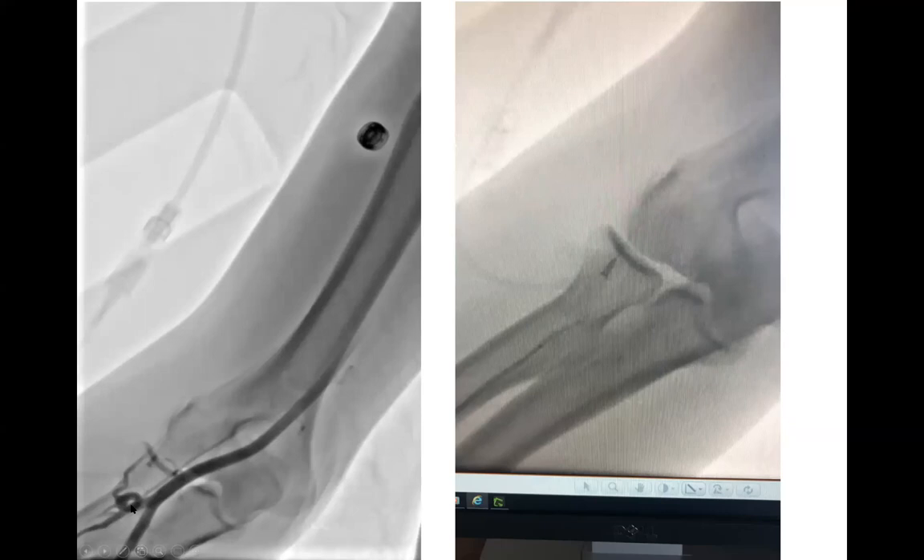We took an image instead. The patient was in his 50s with severe hypertension. The image showed our wire going into what we call an accessory or recurrent radial artery that goes all the way up and joins the axillary. The true radial artery has a loop, and off the start of the loop there's an accessory radial artery — the wire preferentially takes this route rather than the 360-degree loop.